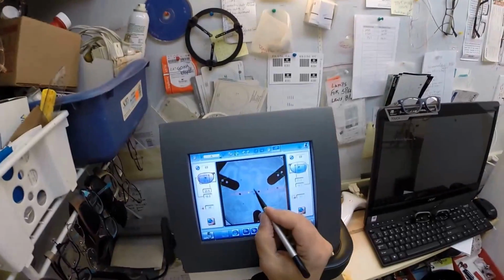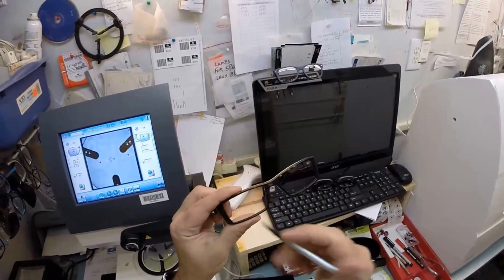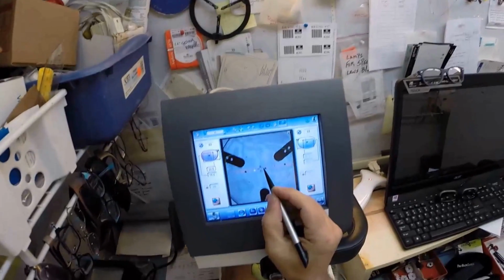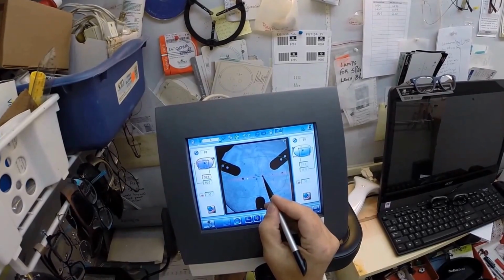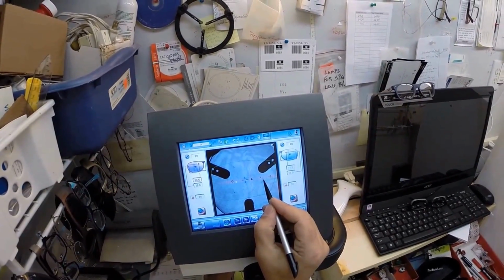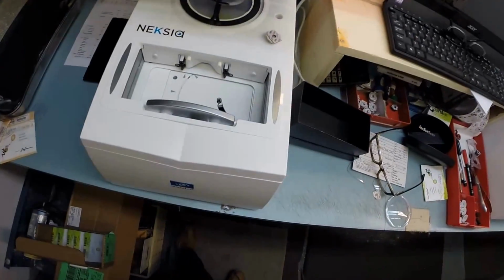So, this blue cross is the geometric center of the lens. This is exactly halfway this way and halfway this way. Your pupil is just inward of that cross and this little yellowish-orange cross. So, I'm going to put that dot there. These two dots go across and get everything lined up perfectly. Hit this button, an arm comes down and places the block onto the lens.